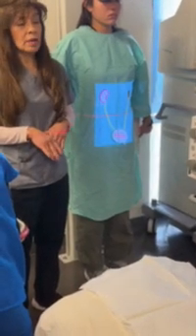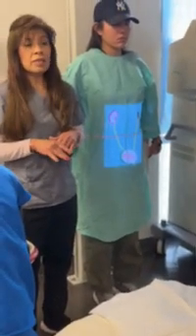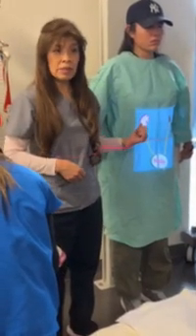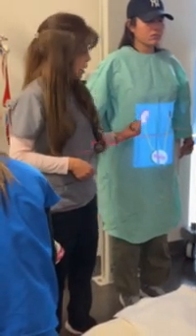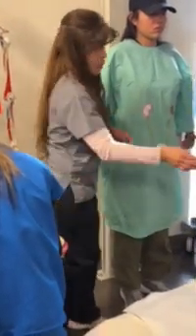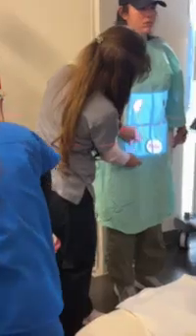Prone. If the doctor says, no, give me, I wanna see if the kidneys are moving, then I'll do this one. I'm gonna do an upright, but I'm not gonna label it post void. I'm gonna label it what? Just upright and your time, okay? And you might put delayed image if you have markers or annotate delayed, okay?